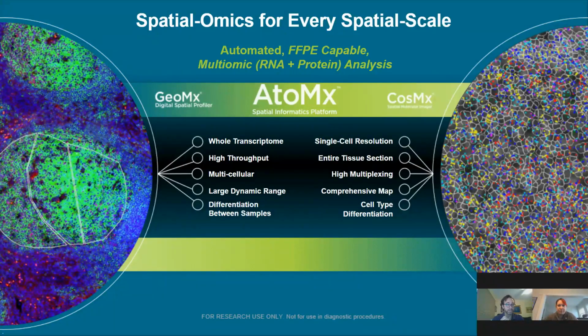Yeah, that's a great question. The way that GeoMx works, the only thing that you're doing is a standard histoprep, and you're only touching the slide with light. All you're doing is collecting things that have physically floated off of it. So GeoMx is by nature non-destructive, and you can work with the tissue afterwards.